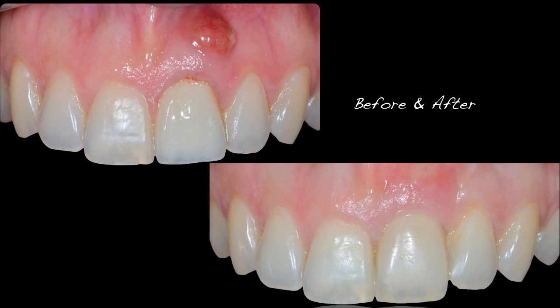And finally, just a look at before and after. The patient came in with a huge acute infection. It was a very challenging case, but the fact of properly diagnosing the case, properly staging the procedures, and of course knowing how to set each stage at the perfect tone, where we first built up the bone with some xenograft, and then allowed for proper maturation of tissues, and then pushed the tissues buccally to recreate a proper contour.